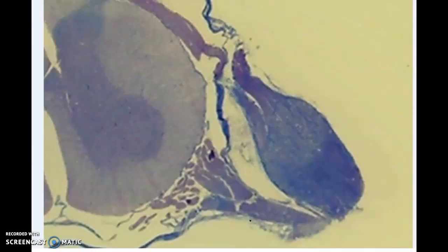The thing we're going to look at is a nerve. On this picture, we have a spinal cord on the left side. Can you figure out the posterior and anterior? There's a big fissure on the front, and you could figure out a definite lateral horn right there. And we have the dorsal root ganglia or posterior root ganglia, that big swelling on the back. But we have a spinal nerve, I don't have a pointer, coming off. So this is a nerve.